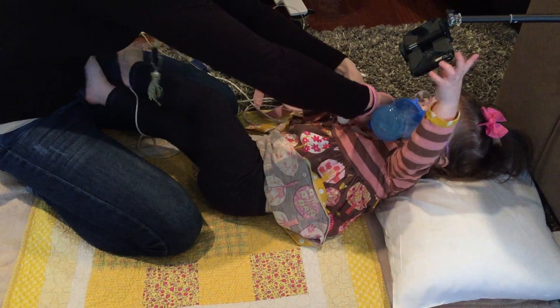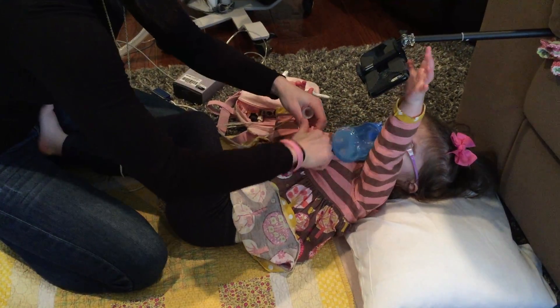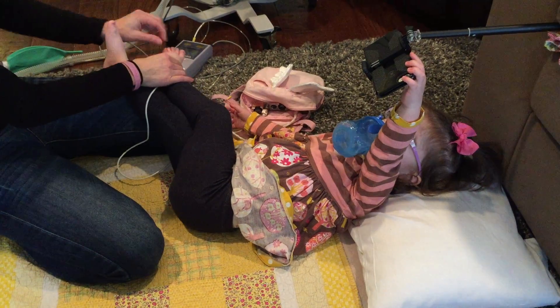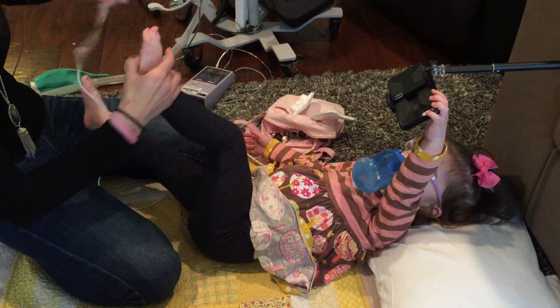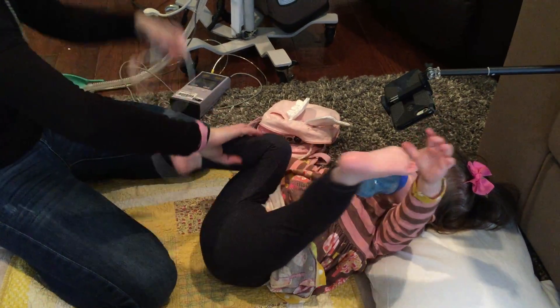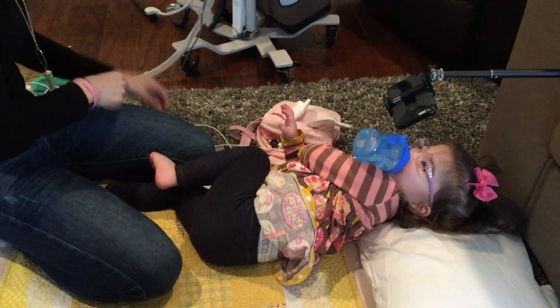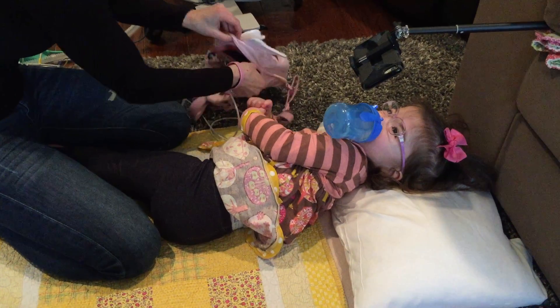I can take her off her monitors because I know she's good. The HME just goes directly on her trach. I'll take her pulse ox off, get everything out of the way, and that's about it. I'll just put the backpack on her so she can go around and be mobile.